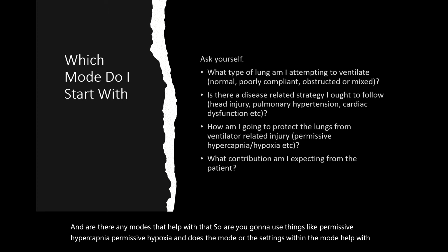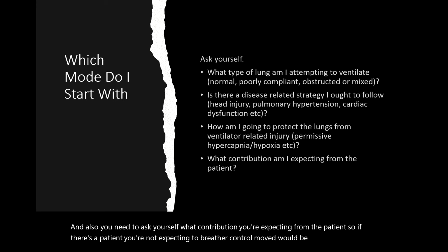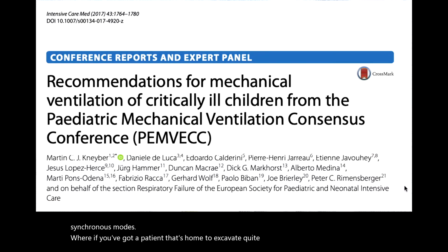And also you need to ask yourself what contribution you're expecting from the patient. So if it's a patient you're not expecting to breathe, a control mode would be fine. Most of the time we want some contribution from the patient, and therefore we tend to go for the synchronous modes. Whereas if we've got a patient that we're hoping to extubate quite frequently, they would go to some sort of spontaneous mode.